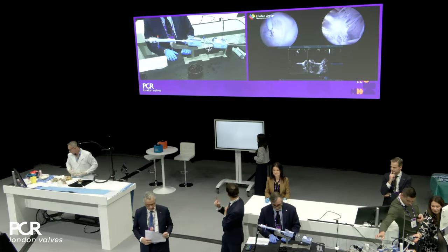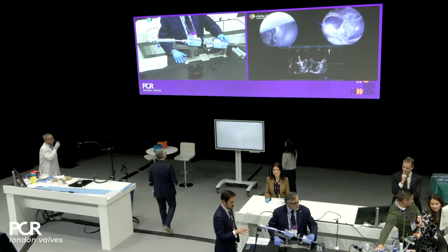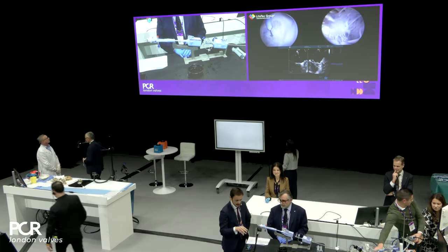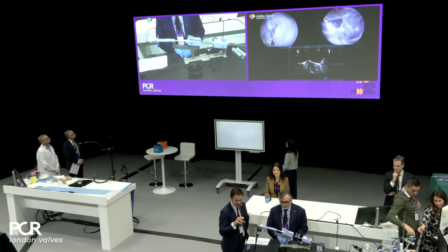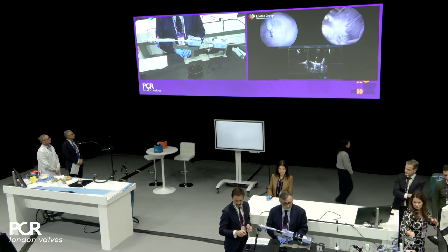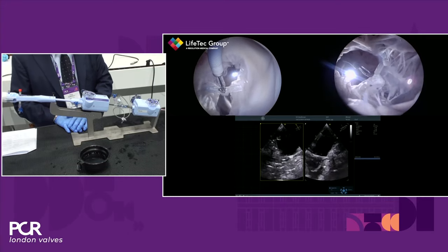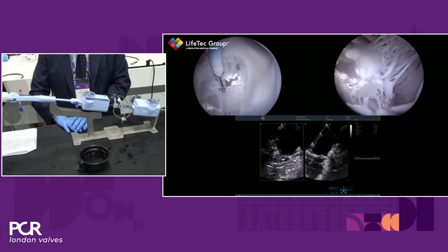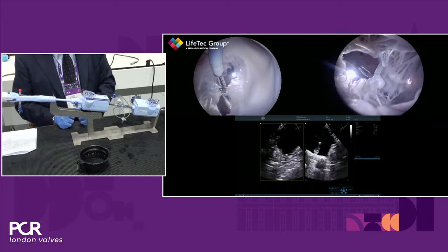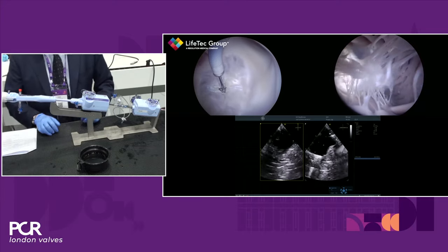Yes, here you can see on the screen there is the beating heart simulator. There are some differences between this heart and a human heart, but for the purpose of this demonstration it is extremely helpful, because you see the valve from above, from the right atrium, the so-called surgical view, and then we see the valve from below, so we see live the chordal distribution, how dense they are, especially close to the papillary muscle, close to the commissure, as we have seen on the specimen. And then we have also the echo, which is actually guiding the procedure in reality. This is an RV inflow with X-plane, which is the view that is used in reality.